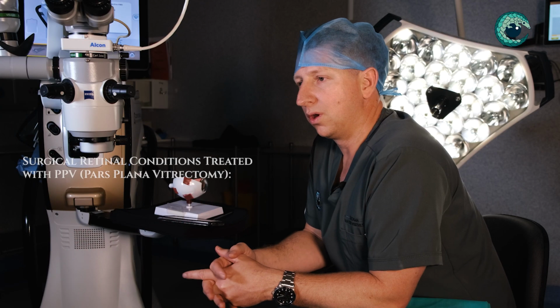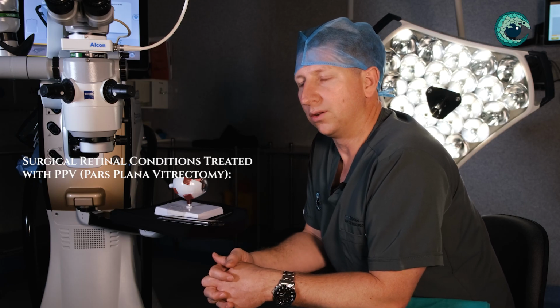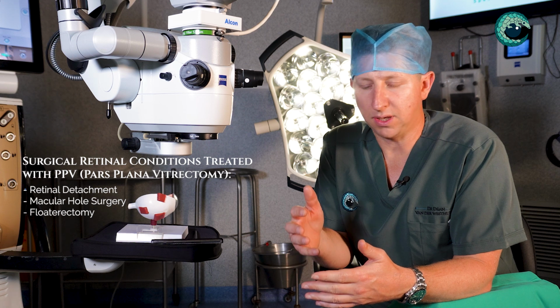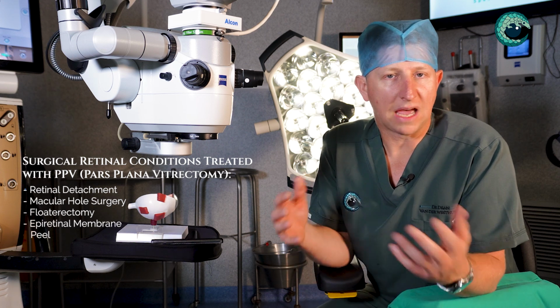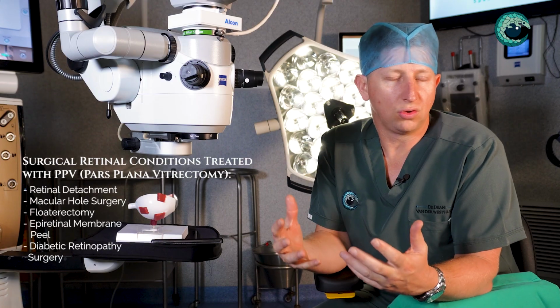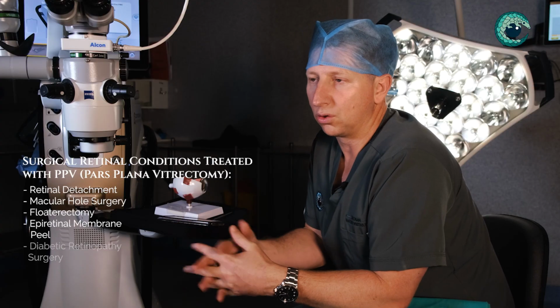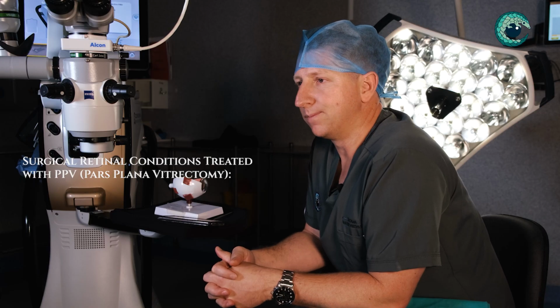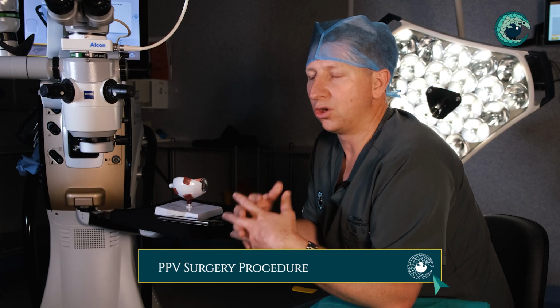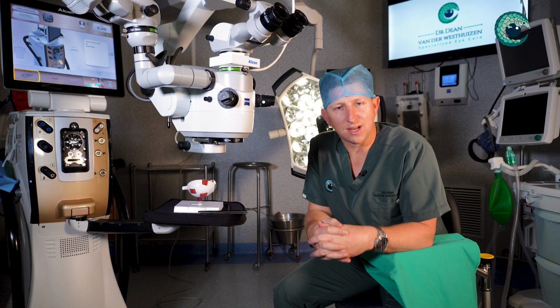So, surgical retinal conditions are normally treated with a vitrectomy. Whether it's a retinal detachment, a macular hole, a floterectomy, epiretinal membrane peel, or diabetic retinopathy, to access the back of the eye and to do retinal surgery, one does a pars plana vitrectomy, often called a PPV. Today I just want to talk through what that surgery entails, so you have a good understanding of what's actually happening at the time of surgery. So we're going to take it step by step.